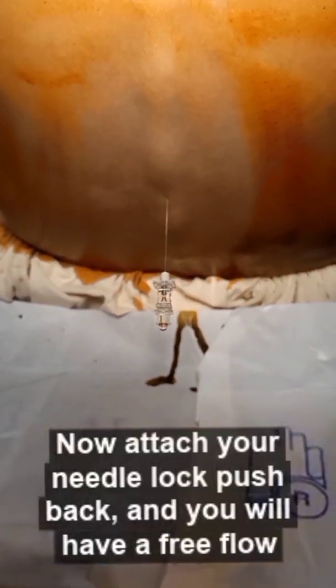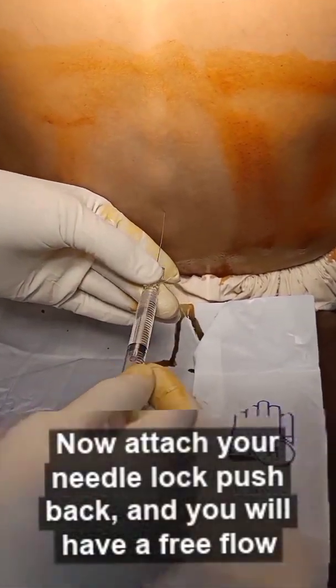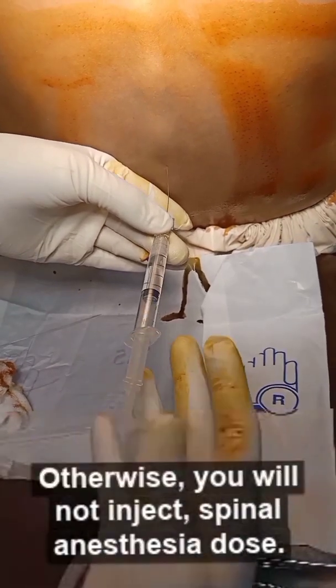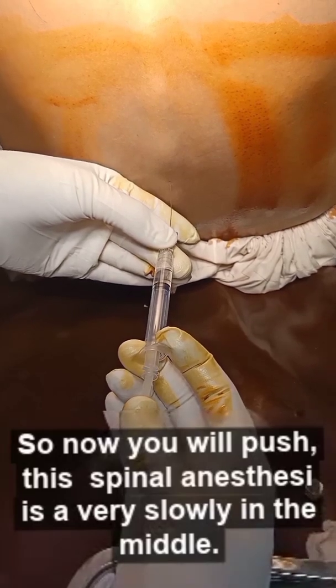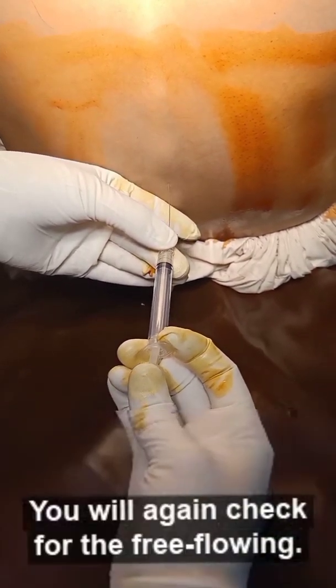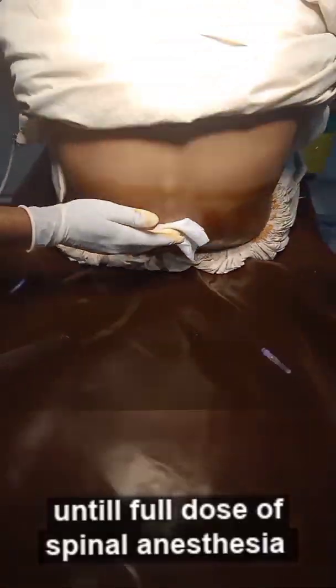Now you attach your needle lock and give negative suction. A free flow must be present on negative suction, otherwise you will not inject the spinal anesthesia dose. Now you will push the spinal anesthesia very slowly. In the middle, you will again check for free flow on negative suction. The full dose of spinal anesthesia has now been given.